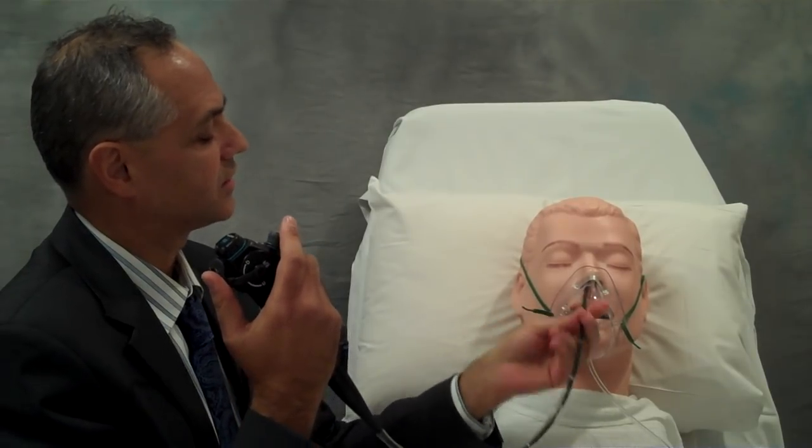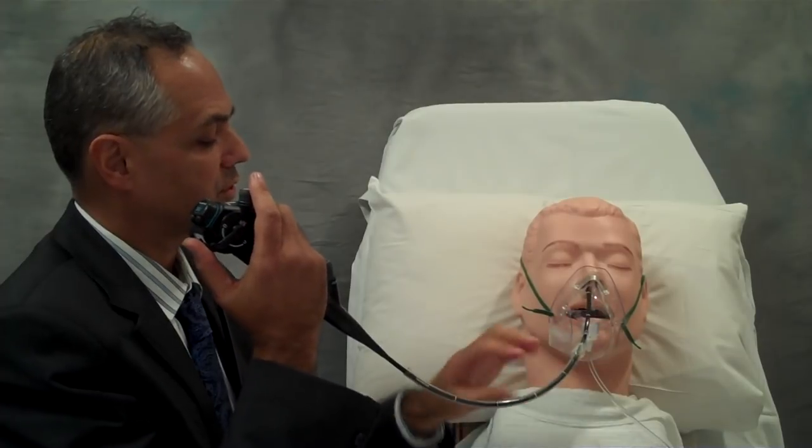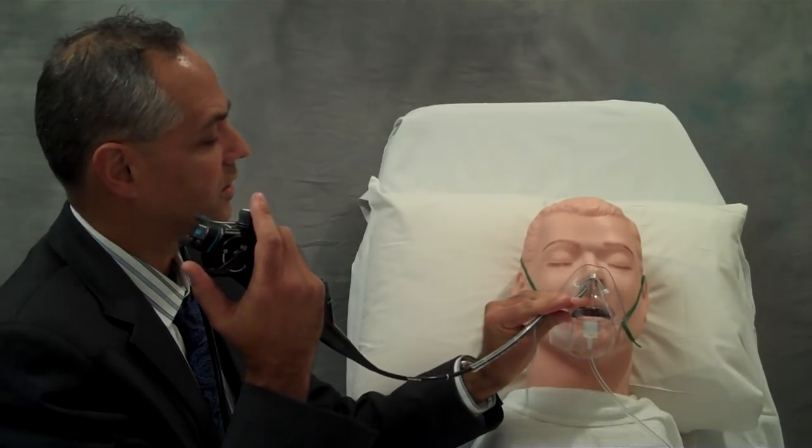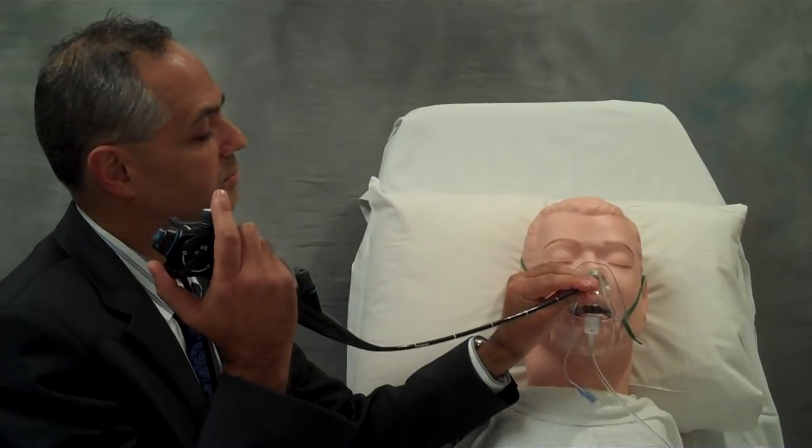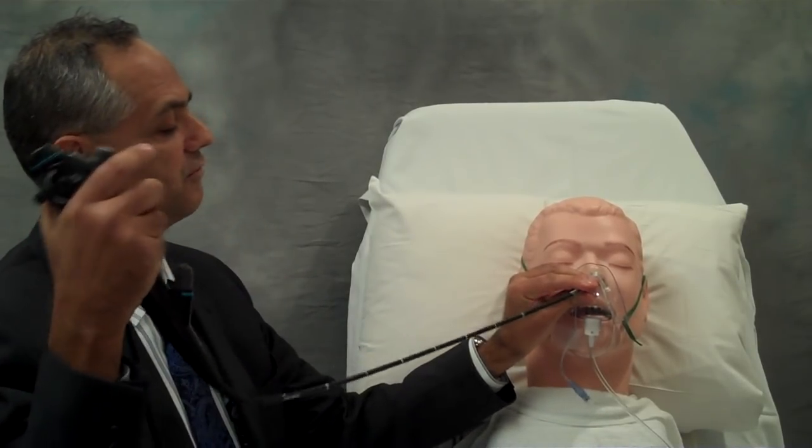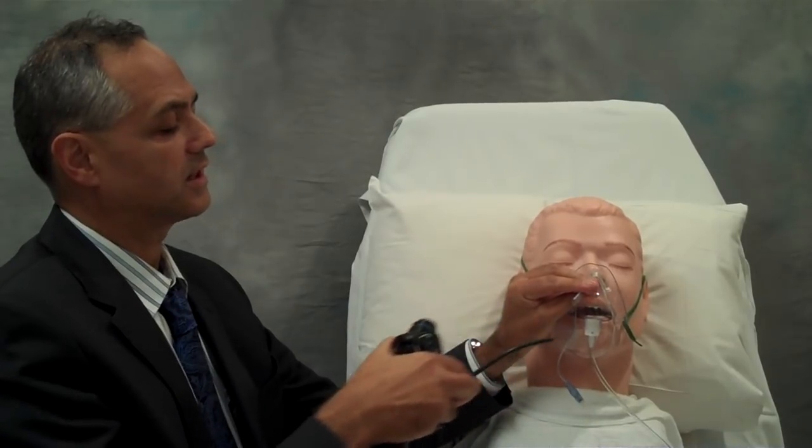The bronchoscope goes down into the hypopharynx, past the vocal cords, and the smaller endotracheal tube is threaded over the bronchoscope into the airway. Once we verify its position inside the airway, the bronchoscope is removed.